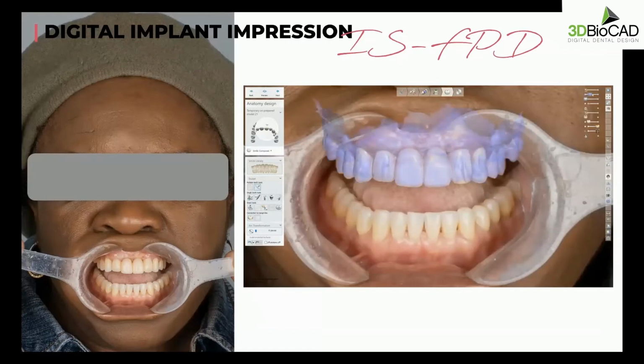And then if you look at the video now, the upper jaw scan is digitally mounted, and then we have the scan body scan also superimposed. Now we have the temporary bridge scan superimposed as well. So now we have the information of the pontic design, emergence profile, and the implant position and everything, and then also the face. So now the lab will be able to fabricate a nice looking final restoration that will not alter the soft tissue contour, because they will copy the emergence profile of the temporary and the pontic design of the temporary.